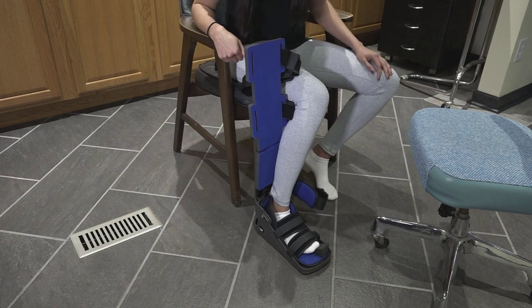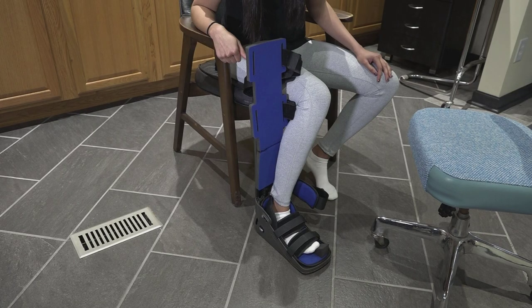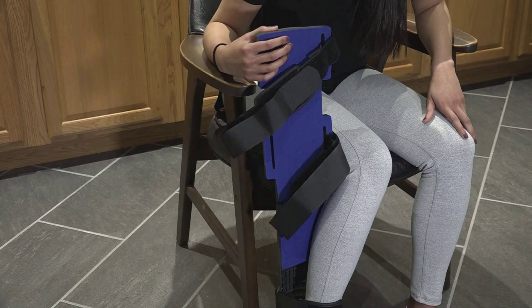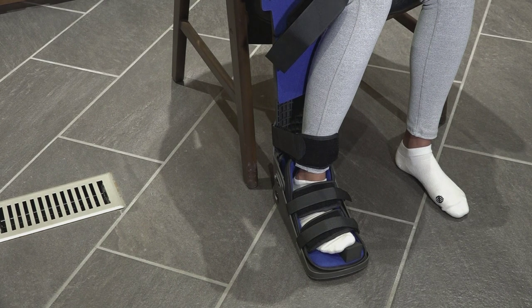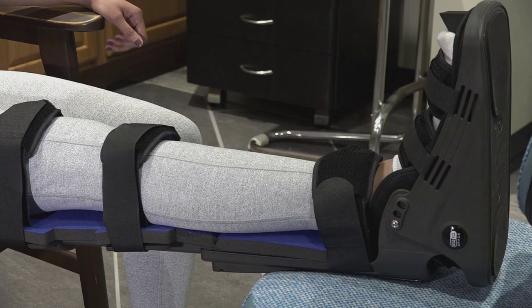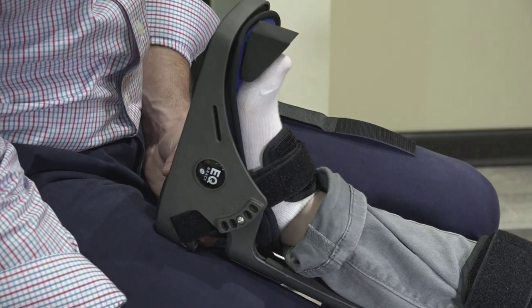The length of the straps can all be adjusted based on your patient's needs. We also recommend reducing the proximal foot strap by feeding it into the lower slots. This will help secure the patient's foot, which provides a better stretch. For smaller patients, you may not need the distal foot strap. It may also be necessary to trim the leg padding for a patient with shorter legs — trim the padding so it does not interfere with the ankle strap. The standard adult size fits from a US women's size 6 up to a US men's size 13.